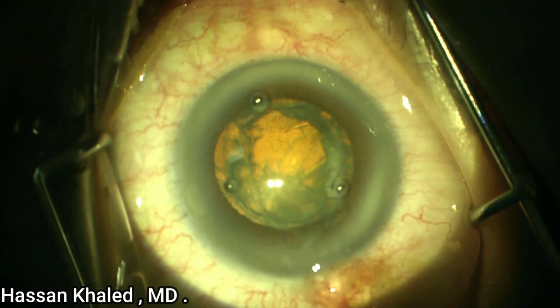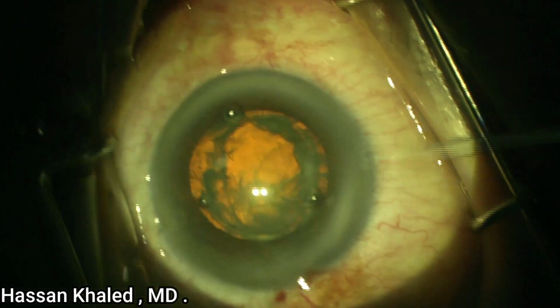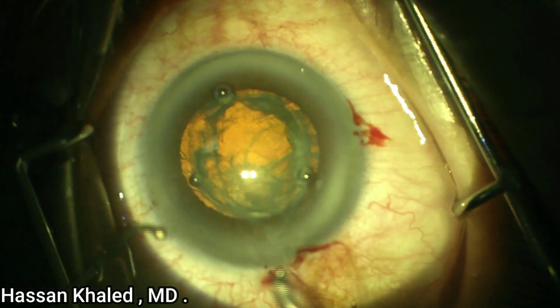Then I open two side ports as it's clear, and also I prefer to rotate the nucleus to be sure that my hydrodissection is complete. Now it's the time of the phacoemulsification.